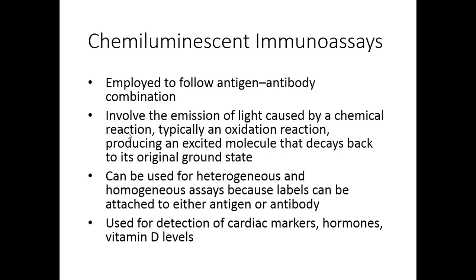And then finally, chemiluminescent. This is another antigen-antibody combination. Chemiluminescence is honestly just the emission of light caused by a chemical reaction, and the chemical reaction is typically an oxidation reaction. That oxidation reaction produces an excited molecule that eventually decays back to its original state.